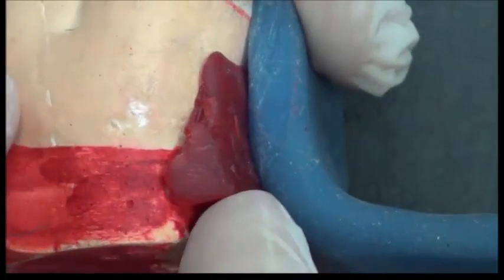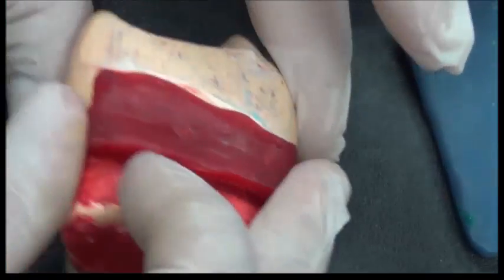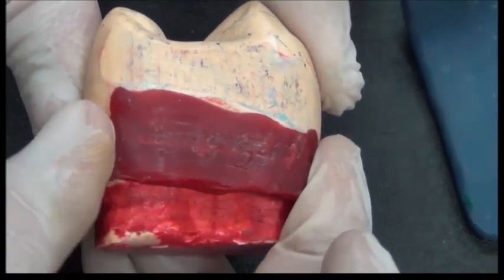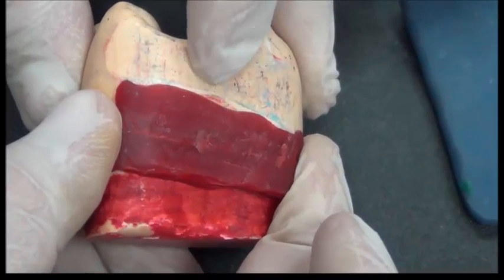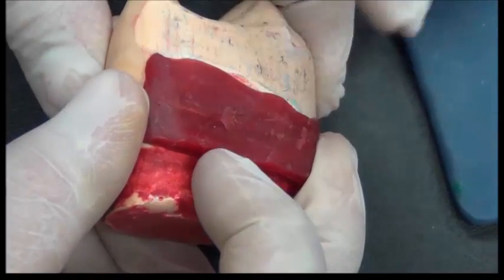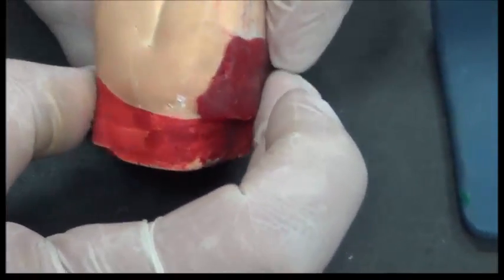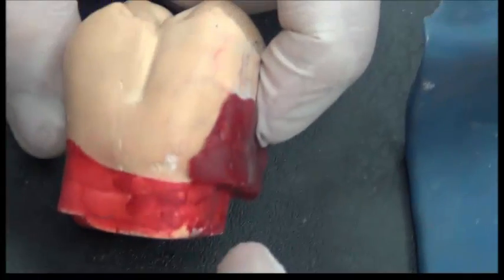So it's flowing away from the gingiva. This structure that we added in wax is called the blockout. A blockout material is placed beneath the guide plane to protect the gingiva. The way we place this wax should be parallel to the path of insertion.